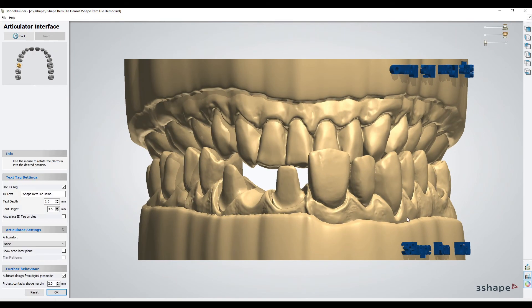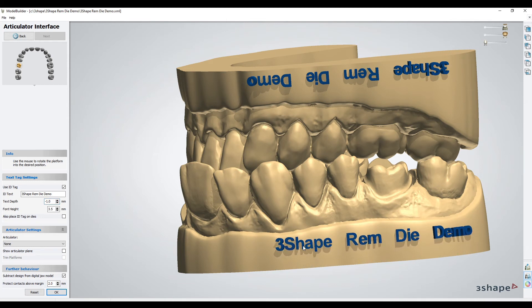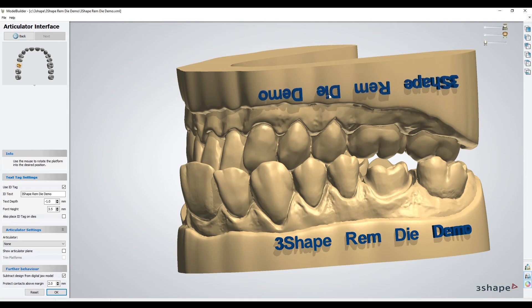The next step is the articulator interface, where you're able to engrave text on the model. It takes the name of the file by default but you can edit it here. The text depth should come in as negative 1 — if it doesn't, make sure it's set to negative 1. That makes it a push-in or negative feature instead of a push-out positive feature. You can left-click and drag the text to reposition it, and you can also add an articulator in this step, although there are additional articulators like the vertex ball attachment articulator available in the next step as well. Once happy, you hit OK.